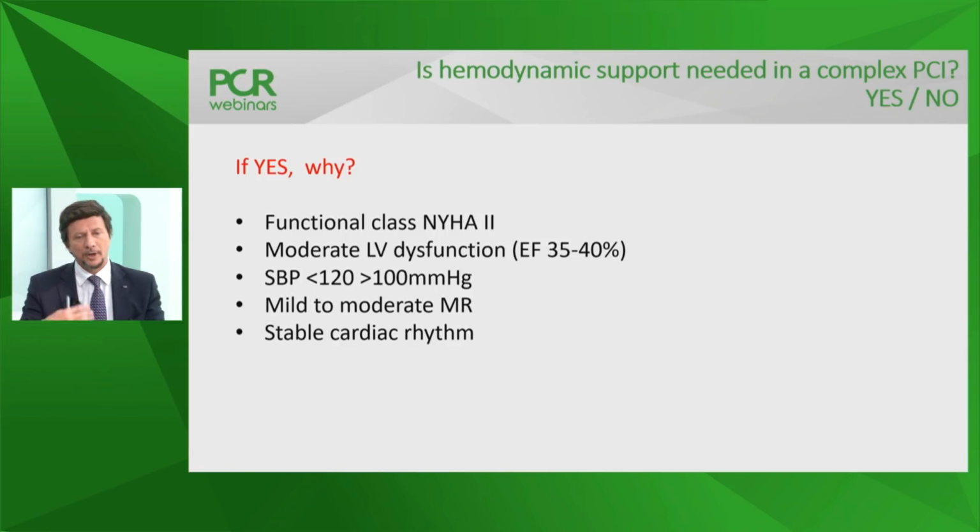In this case, I would go with more aggressive support like an Impella pump, or as one of the colleagues asked there, with an ECMO. ECMO is very effective, but it's very aggressive. I would reserve the ECMO for blood pressure even below 80. Thank you. I think we have other questions here.